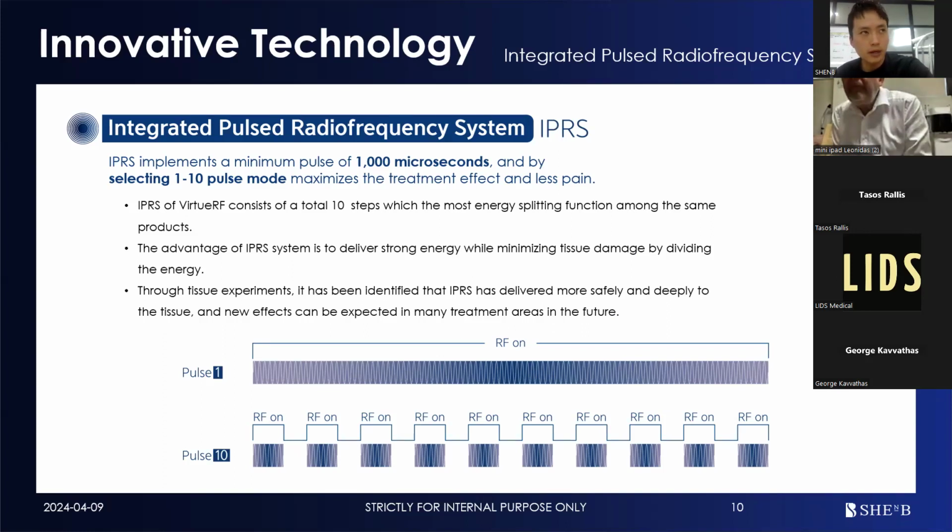So in the market, I believe there are 2 different manufacturers who can do this kind of sub-pulse system. The first one is Silhouette X. Is Silhouette X popular in Greece? It is being distributed now, for the last 2 years, in Greece. They are starting to create some sales. They are in the beginning. They don't have so many installations, but they are here now, and they try.